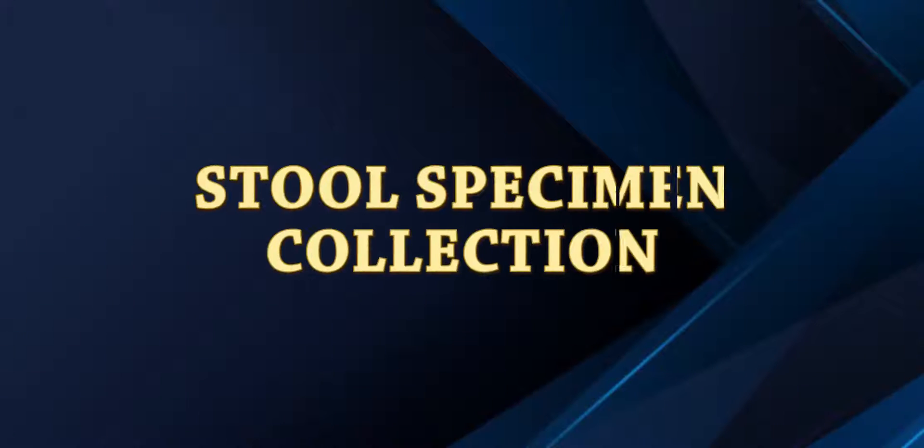In this video, I'll be showing you how to take a sample of stool, and our objective is to learn how to collect a stool specimen.